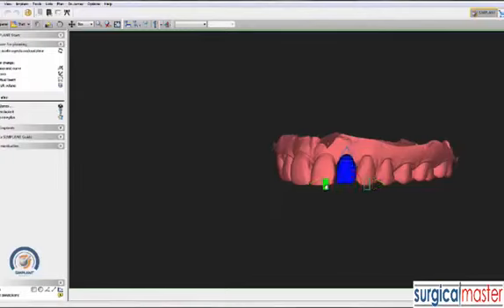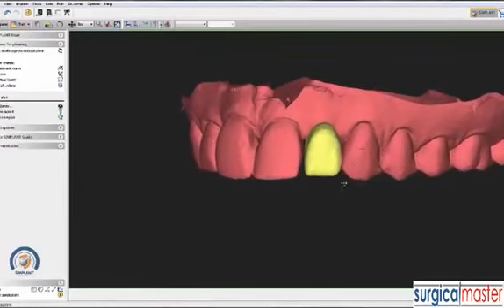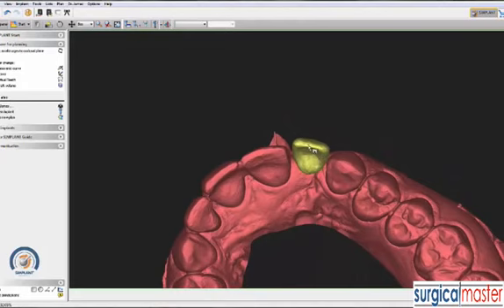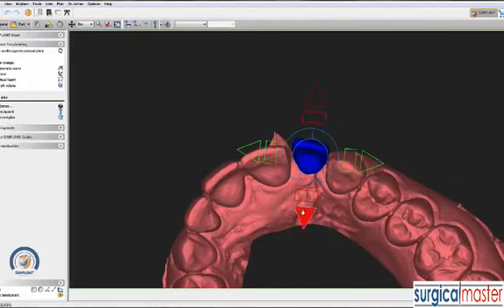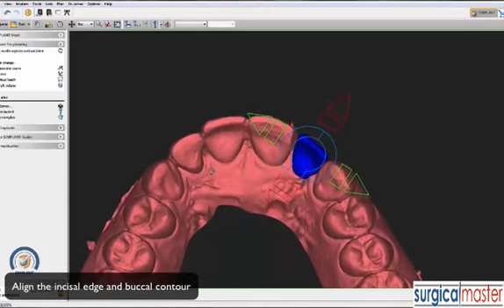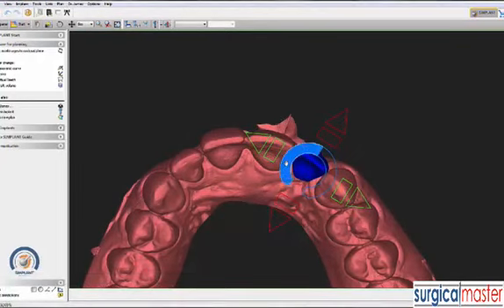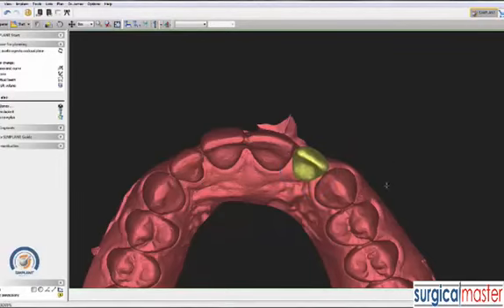We can make it a little bit wider and maybe shorter as well. We won't have an ideal emergence profile because both of us saw the deficiency on the buccal. But at the very least, what we can do is align the virtual wax-up so it aligns with the arch and the incisal edge. If we have multiple teeth to replace, we'd need an actual wax-up because that becomes more complex, but for one tooth this is relatively reasonable.